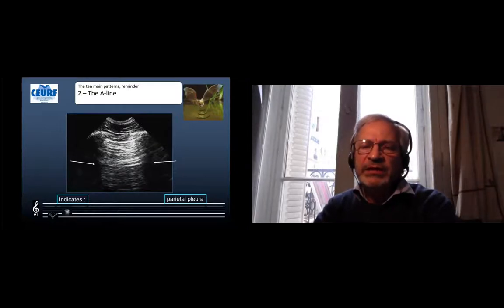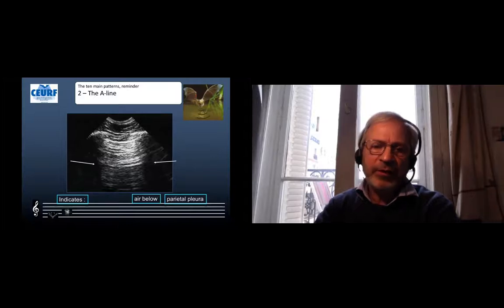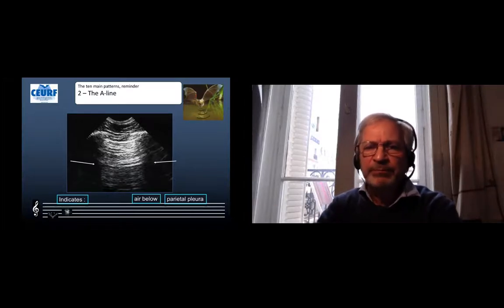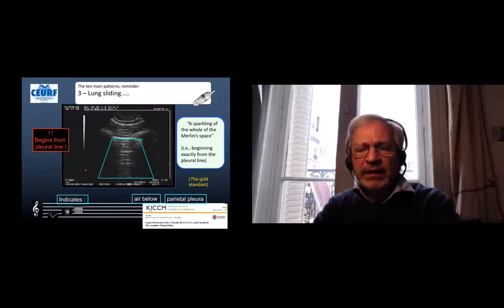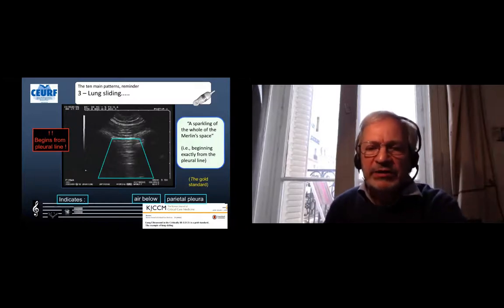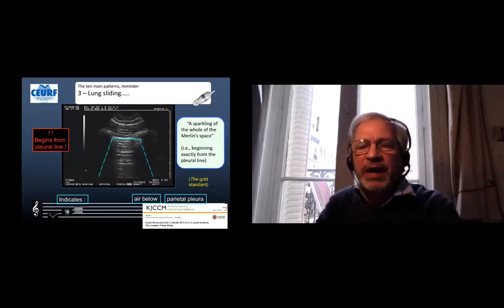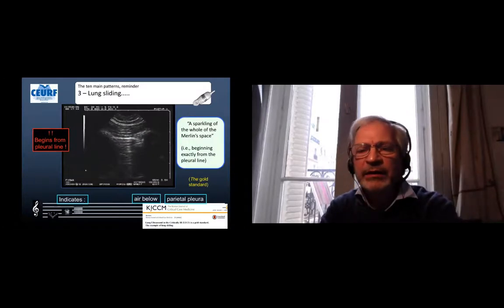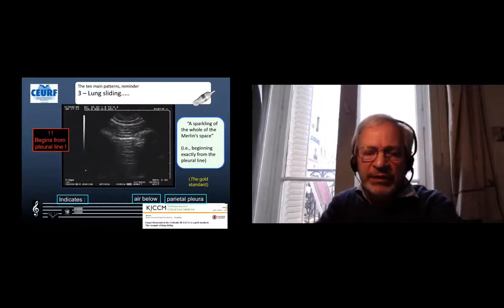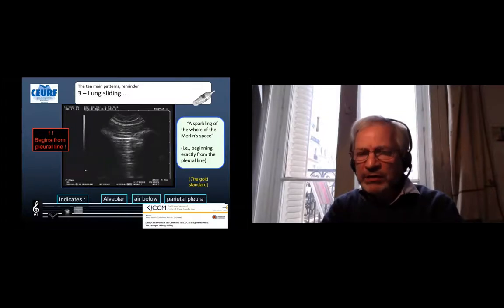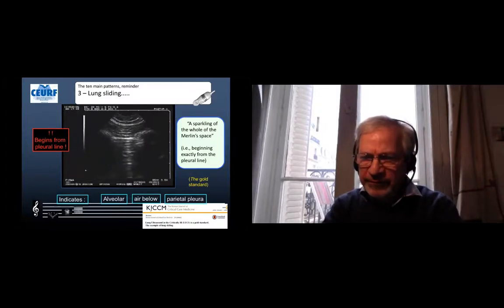The A-line is a repetition of the pleural line which indicates that below the pleural line we have aeric structures, alive or dead, we still don't know on this image. The lung sliding is the third sign, very basic. In this rectangle that we call the Merlin space, we can see a sparkling that begins exactly from the pleural line. You can see only the pleural line or the whole of the Merlin space to see that the air which is below the parietal pleura is alveolar air, which means there is no pneumothorax on just this image.